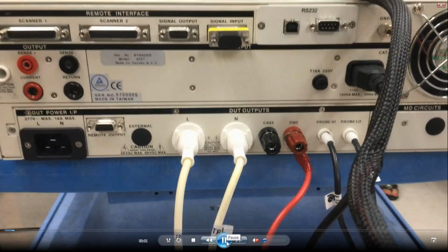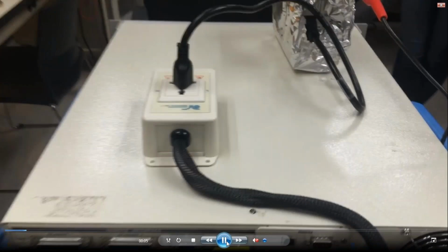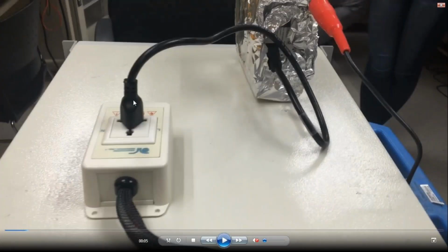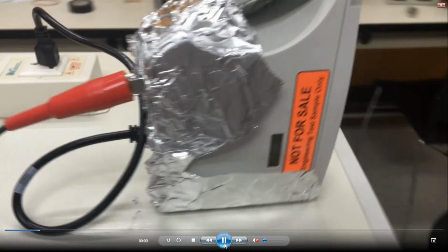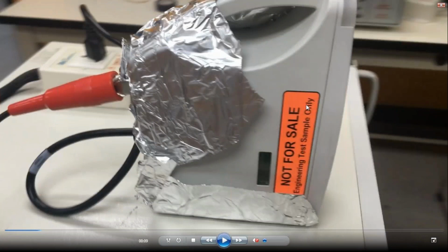What you're going to see next is that it goes to an adapter box. So you have, again, line, neutral, and ground where a medical device is plugged in. Since this medical device did not have any metal points that we could touch, it's all plastic. It doesn't have any metal parts that could be energized, but the standard still wants you to check for leakage current on this kind of product. What they ask you to do is take an aluminum foil the size of a human hand to replicate some kind of leakage current that may flow through the plastic material that's here.